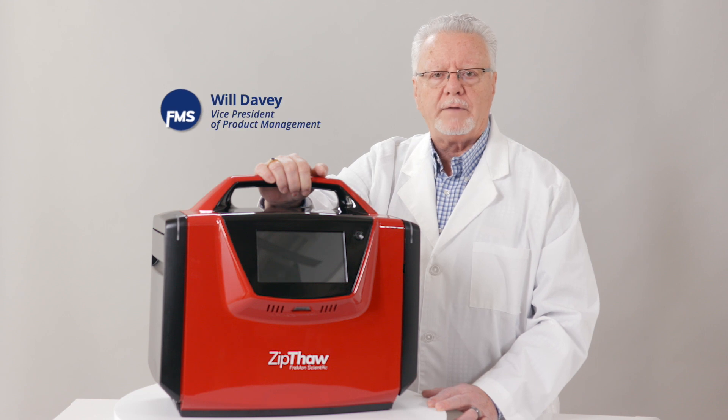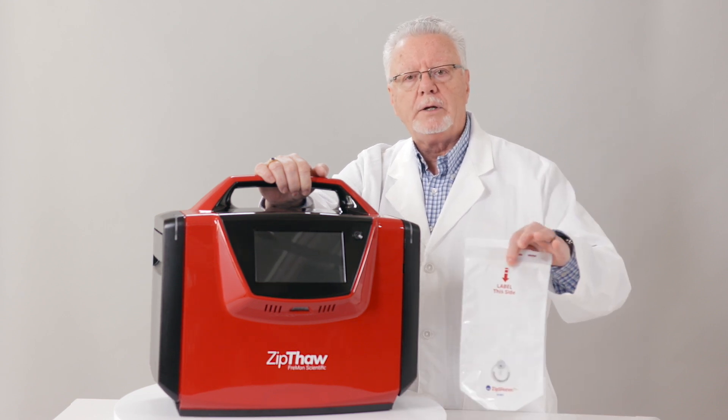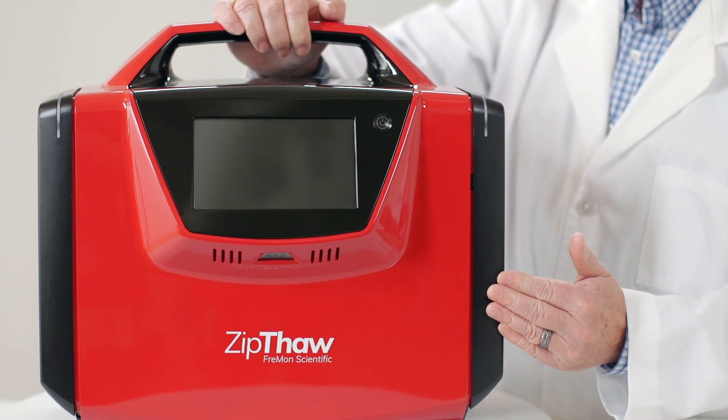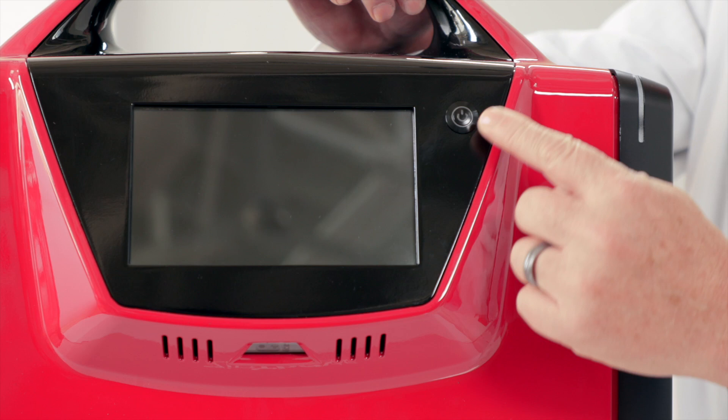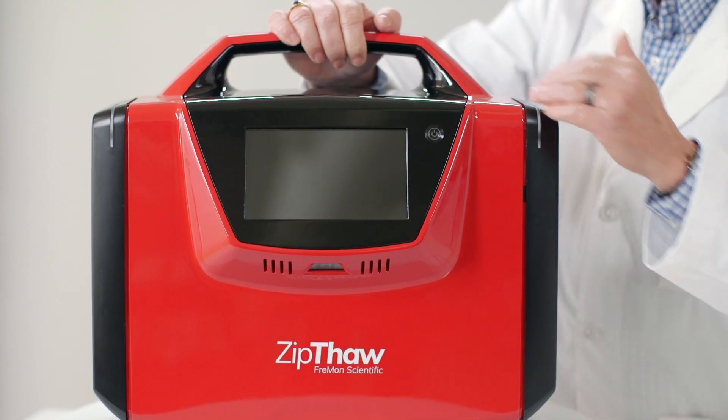Here's the Zip Thaw thawing device and Zip Sleeve — a dry plasma thawing device with an anti-contaminant barrier. This is the Zip Thaw front panel. Here's the touchscreen, the power button, the barcode scanner, and here are the chamber lights.